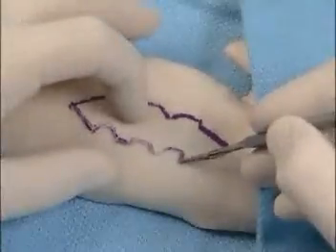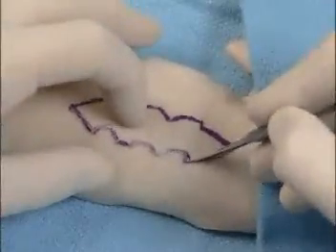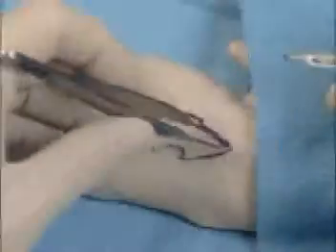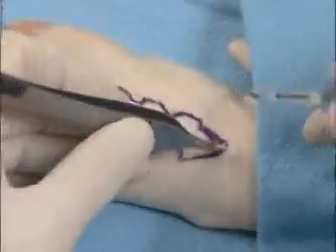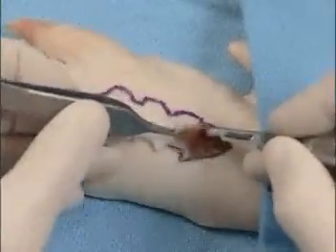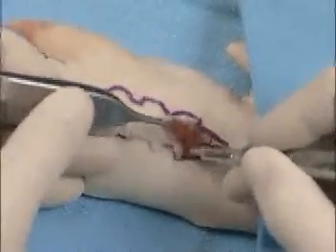Because of the toughness of the pig's skin, the geometric shapes here are accentuated, certainly larger than what we would perform on a human in scar revision technique. Here we can see the undermining, using either a 15 blade or the scissors.